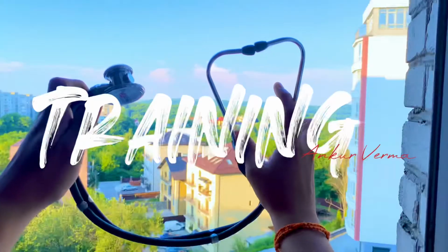My summer training has started. I really wanted to shoot my first day, but going there I focused more on learning rather than filming. So today we are talking about stethoscope.